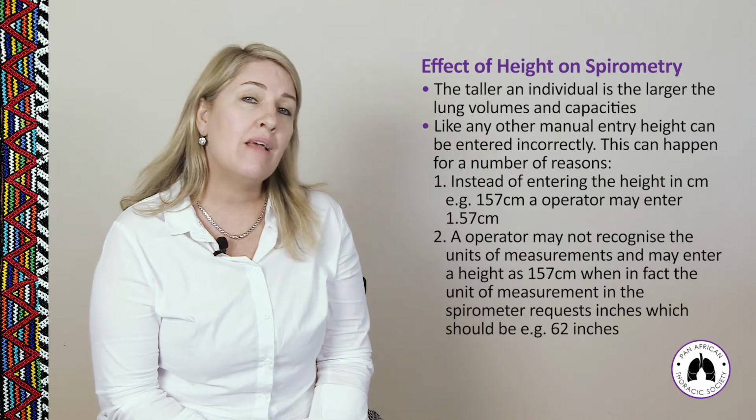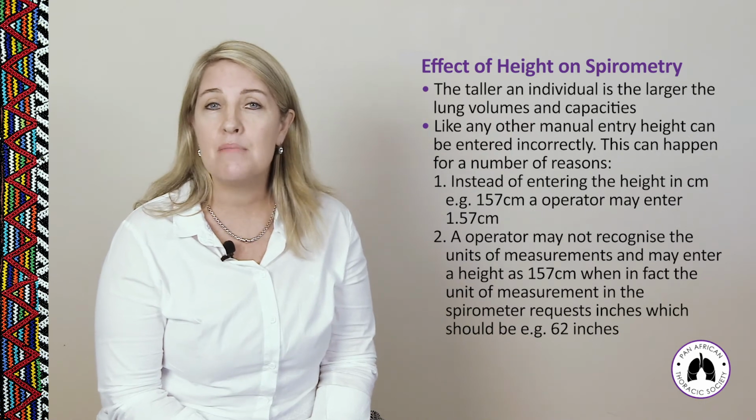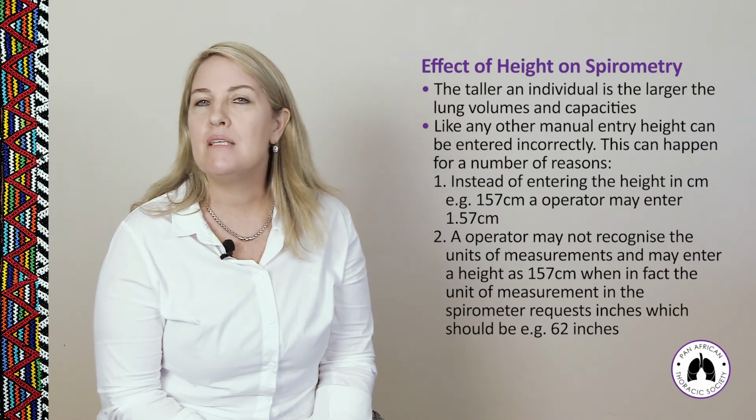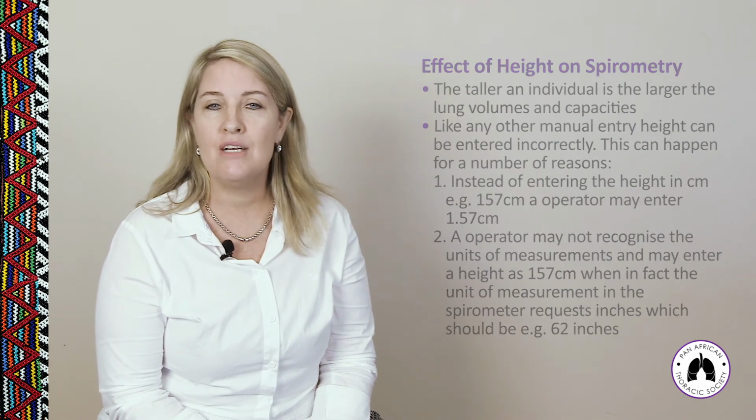Another error that I've seen is that the operator may enter the patient height in centimeters, but the machine may be set up to give the height in inches. So again, you would have some error on your data entry.